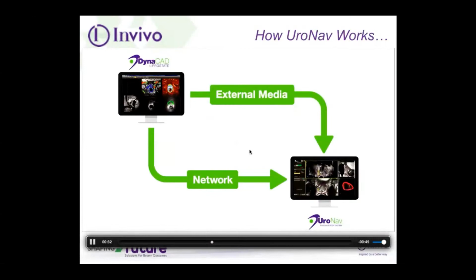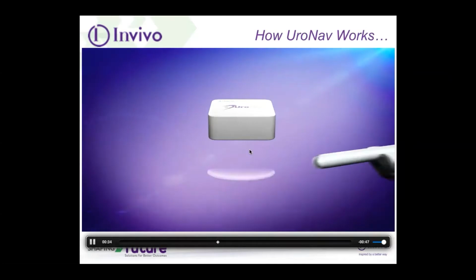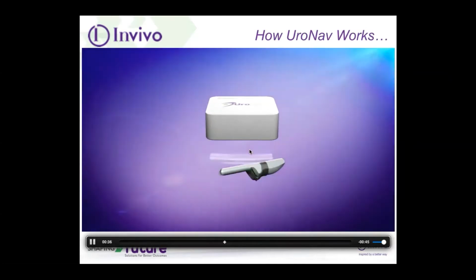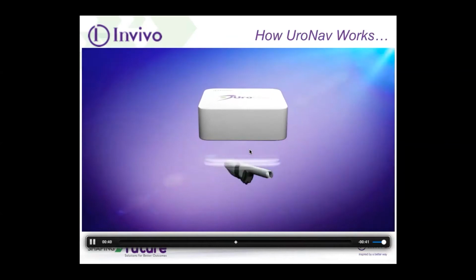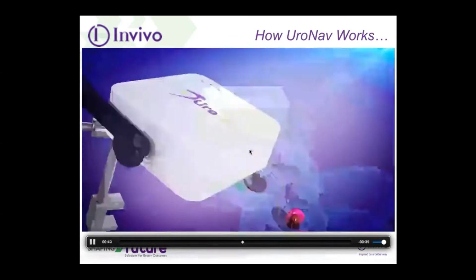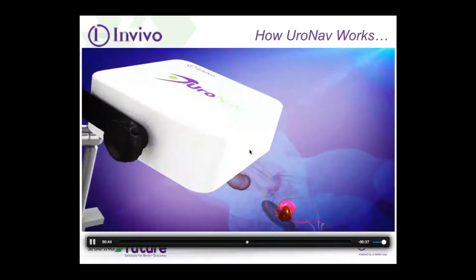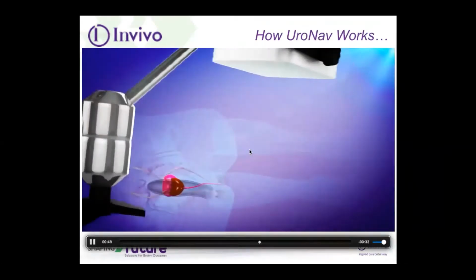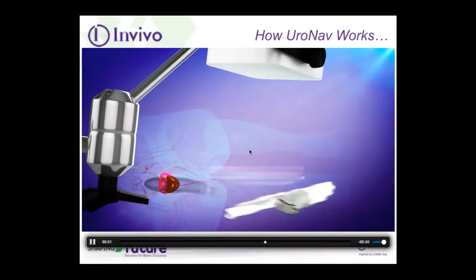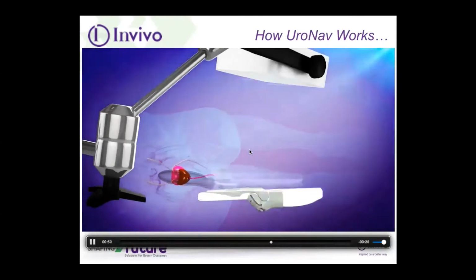So that you and the radiologist look at the imaging, either you or the radiologist can mark the region of interest, which is a 3D image. So you make a 2D procedure into a 3D imaging modality. And you can see that now you can find the tumor directly within the prostate and target it. You can also match it with a standard biopsy so you prevent error of missing anything within the prostate.